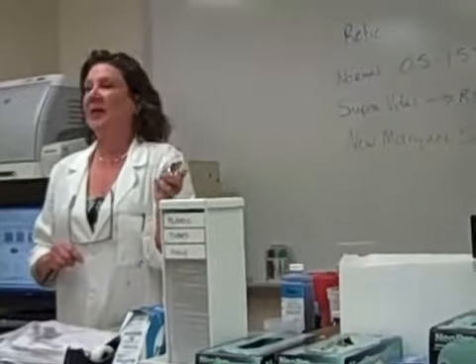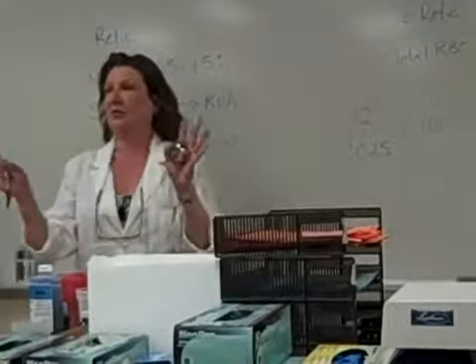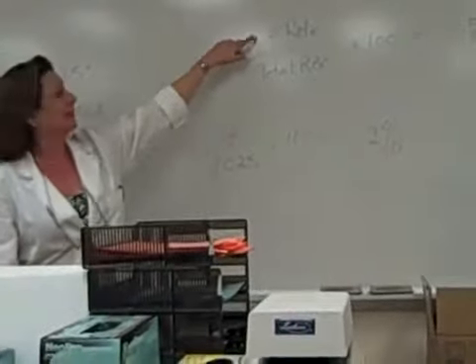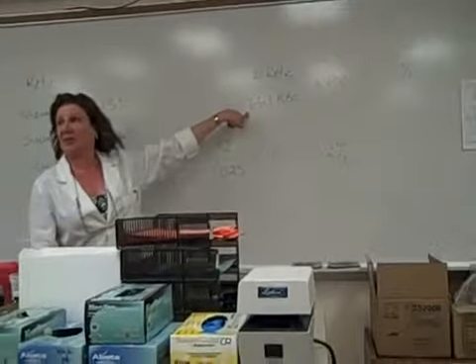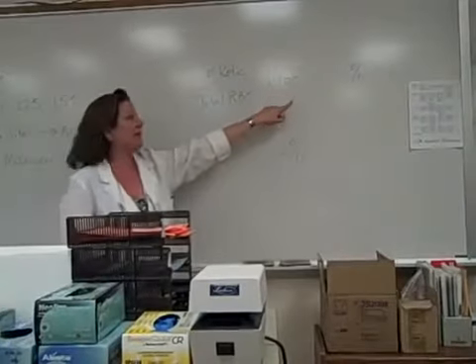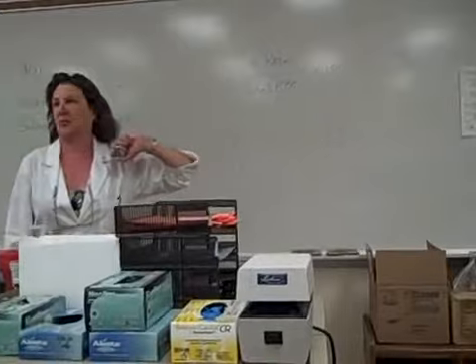Okay. When you run across a retic, use your diff counter and count a retic. So, is a retic a red blood cell? Potentially, yes. So it's going to go in our denominator here. So the formula ends up being the number of retics you see divided by the total number of RBCs you count times 100. Okay, and that gives us percent. Okay, give me 1 decimal point today.